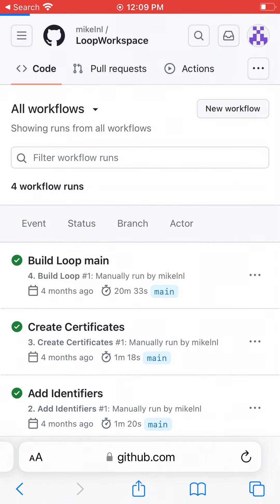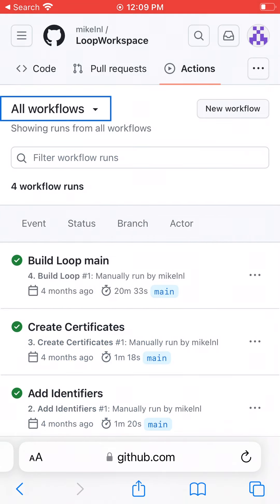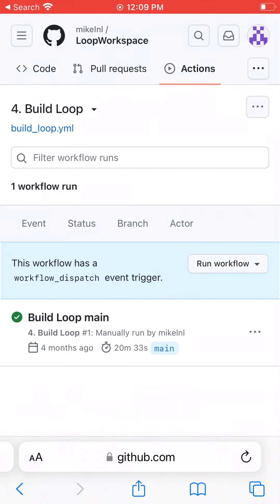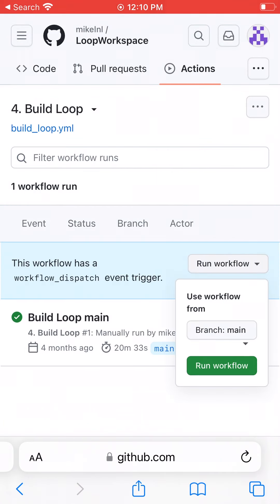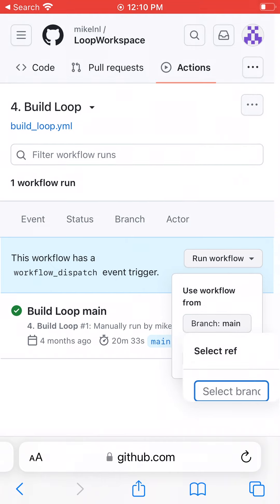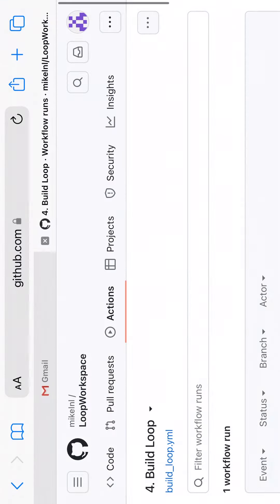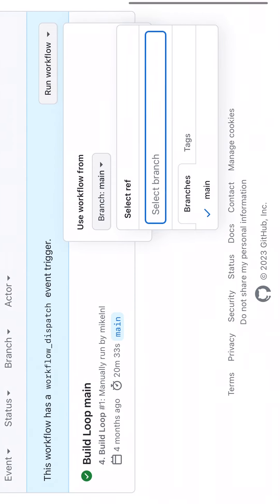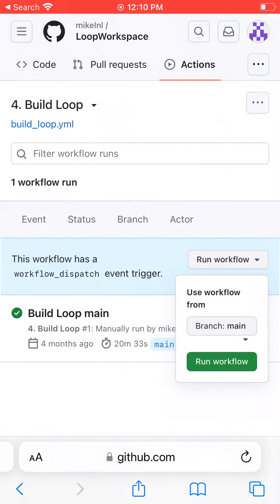To rebuild, tap Actions at the top. In portrait mode, you have to tap All Workflows first, and then number four, Build Loop. Hit Run Workflow and confirm it says the branch you want to build. If you want to switch to a different branch, you might have to use landscape mode to see the other branches. I only have the main branch available on this, but if there were more, they would show up in this list. Hit the green Run Workflow button.